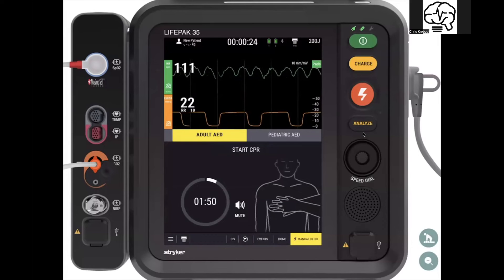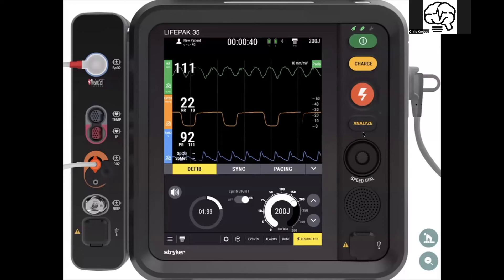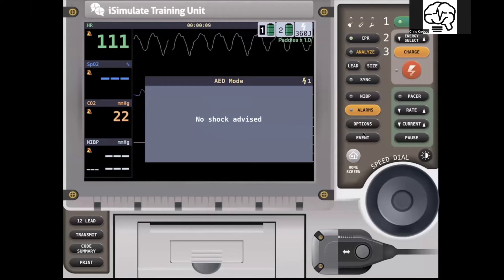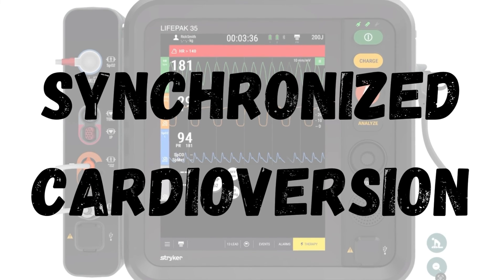The LifePack 15 also has CPR Insight occurring underneath, and if it detects the rhythm to be shockable, it will pre-charge prior to the event. If you need to kick out of it, just hit manual mode and it kicks right out. On the new LifePack 35, everything lives in that therapy dashboard at the bottom.